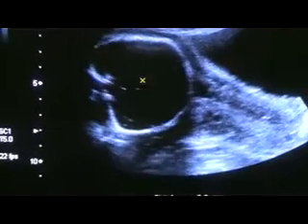This is a case of anhydramnios with placenta on the posterior wall. This area is the placenta. As I go down, we see the cervix. This is the cervix. This is the urinary bladder. Head of the fetus — cephalic presentation.